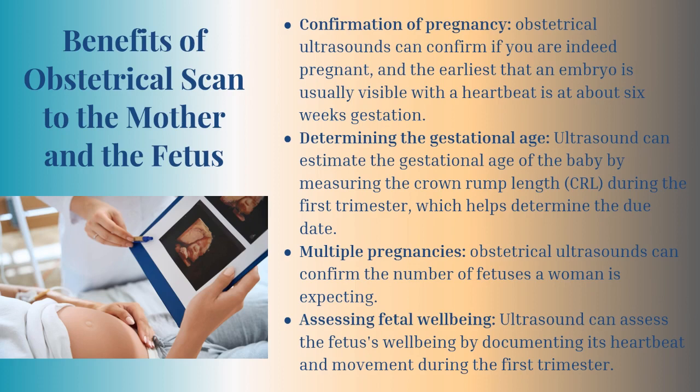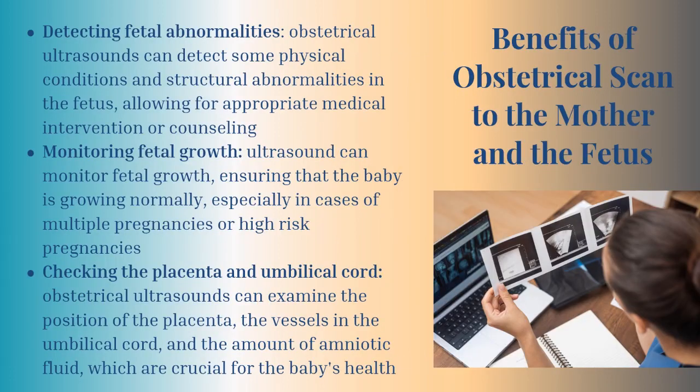Assessing for fetal well-being: it can assess and document the heartbeat and movement during the first trimester. Ultrasound can also detect fetal abnormalities, some are physical conditions and structural abnormalities in the fetus, allowing for appropriate medical intervention or counseling. Monitoring of fetal growth, ensuring that the baby is growing normally, especially in cases of multiple pregnancies or high-risk pregnancies.